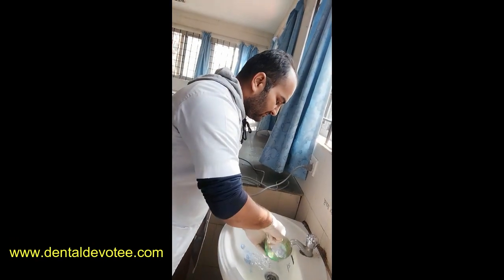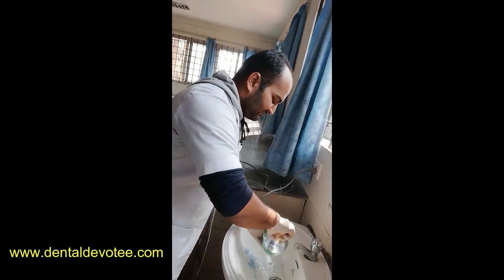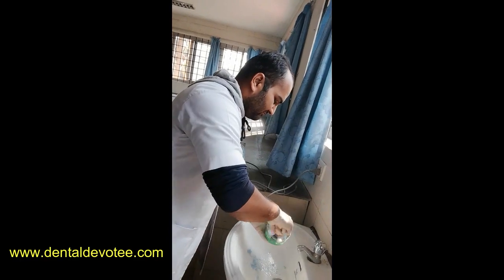So guys, Dr. Raman is about to make his own impression using Alginate.